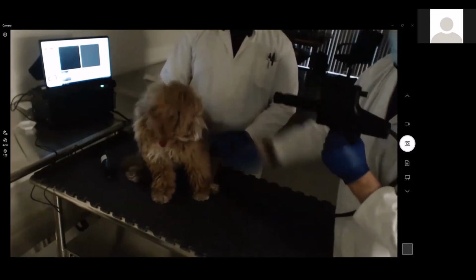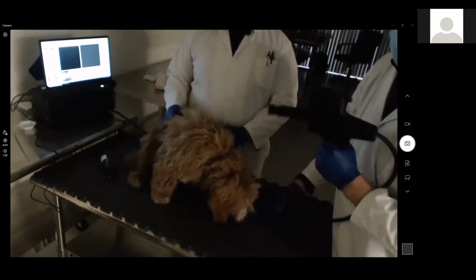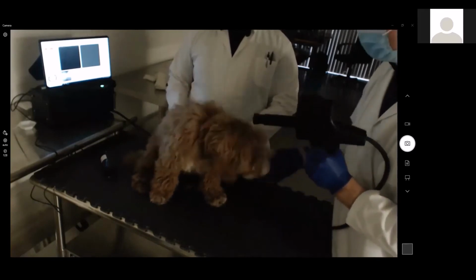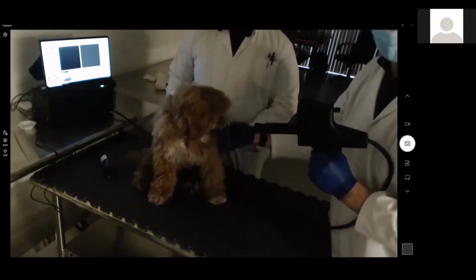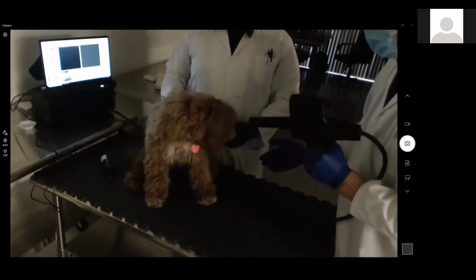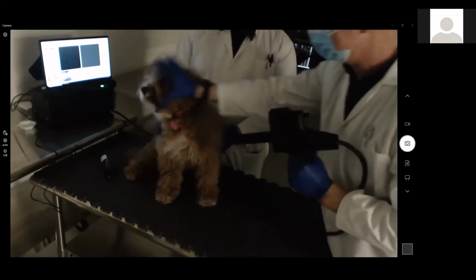So we'll capture some video of me doing this another time if I don't get it, and we'll send that out, okay? But you can see it's a bit of a challenge that any animal trying to do a wake, every animal's personality is going to come into this in terms of how easy it is to do.